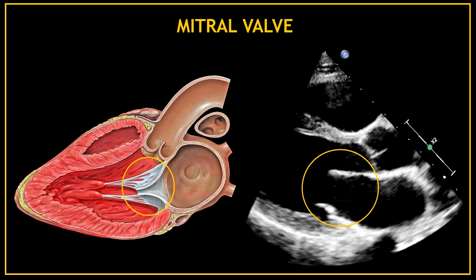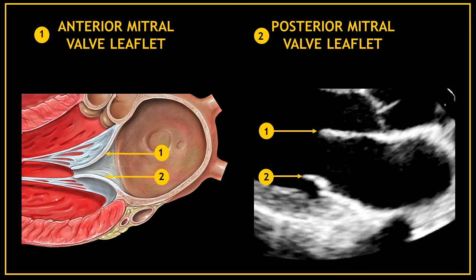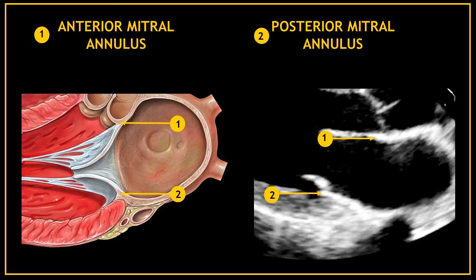The second valve at the bottom is the mitral valve. The first line at the top corresponds to the anterior mitral valve leaflet and the second line at the bottom corresponds to the posterior mitral valve leaflet. The mitral valve annulus serves as an insertion site for the leaflet tissue — the first arrow is pointing to the anterior mitral annulus and the second arrow is pointing to the posterior mitral annulus.